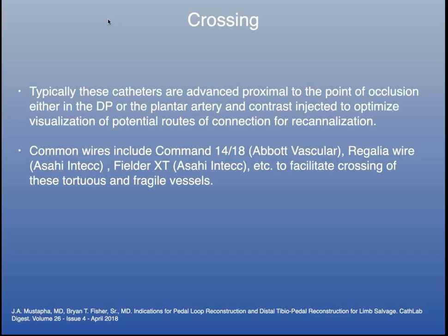You want to do a good angiogram or contrast injection, because that way you'll visualize those potential routes of communication or recanalization. So remember, just like I showed you below knee, your sheath in the common femoral artery versus the popliteal artery, in this case, it's the difference between your sheath and catheter in the popliteal artery, and specifically within a distal tibial or dorsalis pedis or lateral plantar artery, etc.